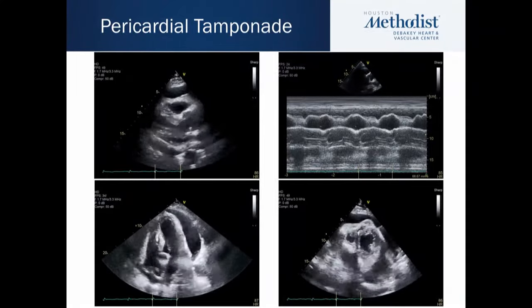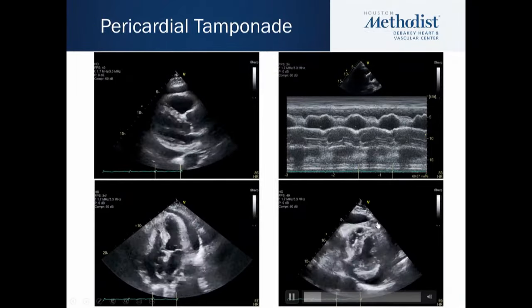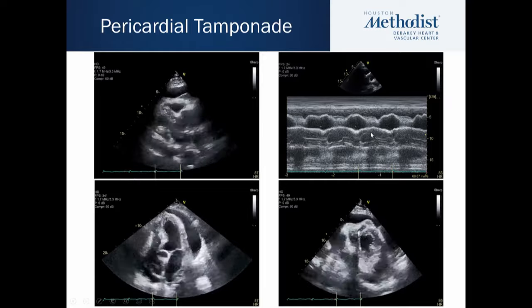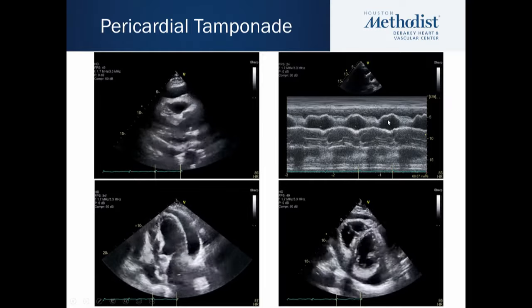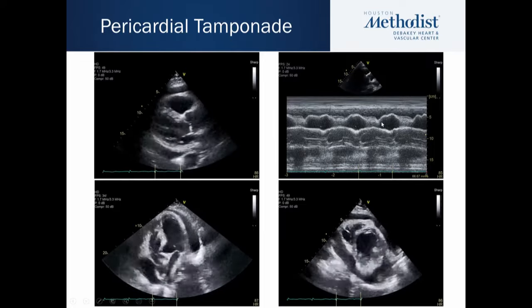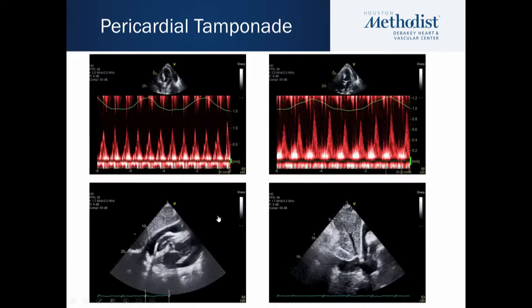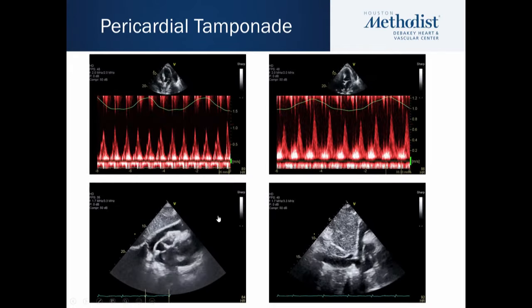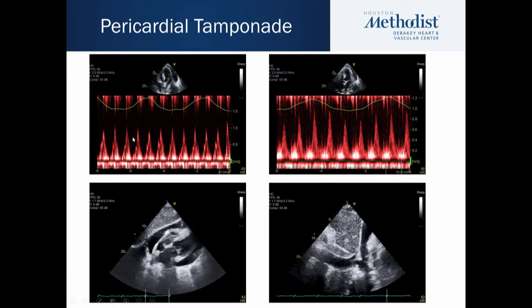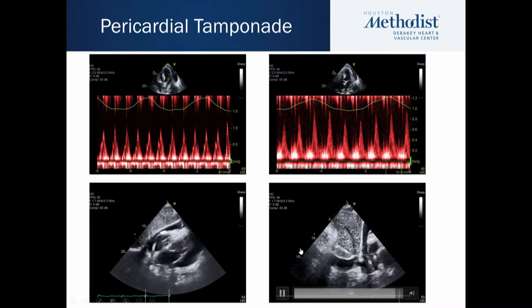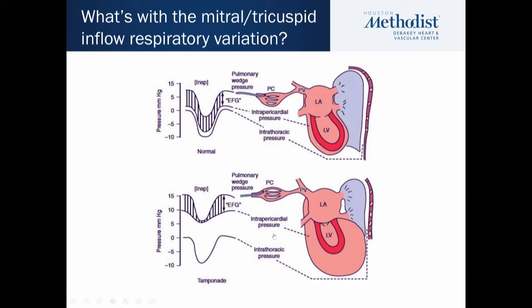Let's talk about tamponade. Here is an easy case — a large circumferential effusion. Notice the compression of the right ventricle during diastole. Always look at the M-mode, using its very high temporal resolution to establish inversion of the RV free wall in diastole. Notice also the right atrial compression during systole. With pericardial tamponade there's going to be respiratory variation — you can see variation in the mitral inflow and pulmonary veins, as well as a dilated IVC consistent with high right atrial pressures.